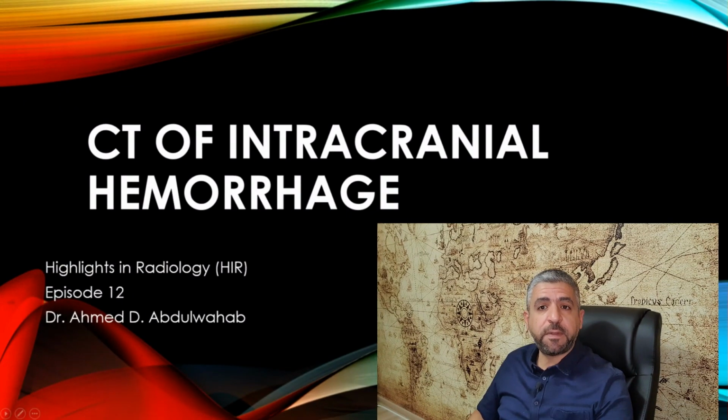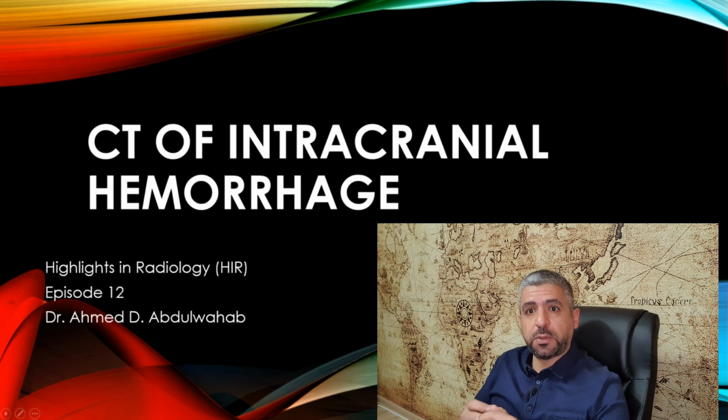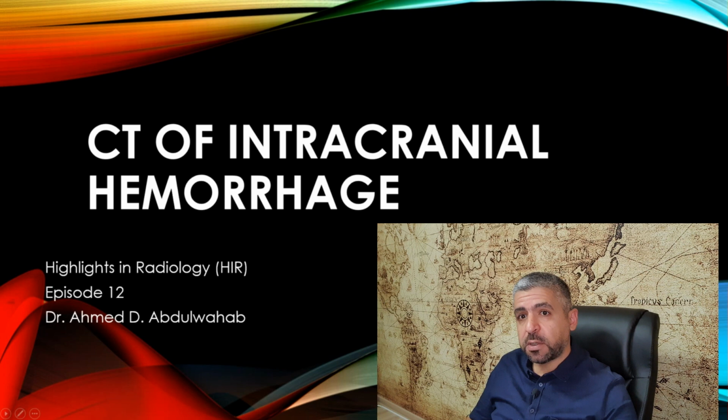In today's episode, we will talk about a very important subject, and that is the CT of intracranial hemorrhage. It's one of the most common emergencies, and I think every radiologist needs to have the basics of what they are, how they are distributed, and how they look on a CT scan, because our radiology report in this condition will be very significant to the management of the patient.